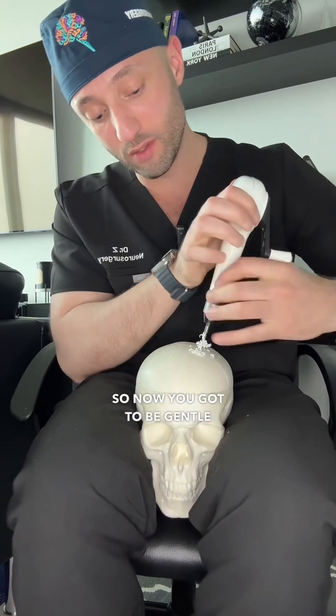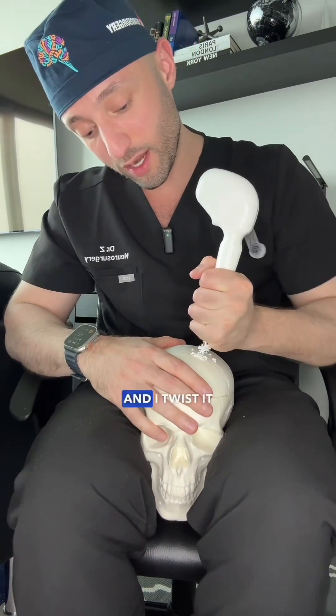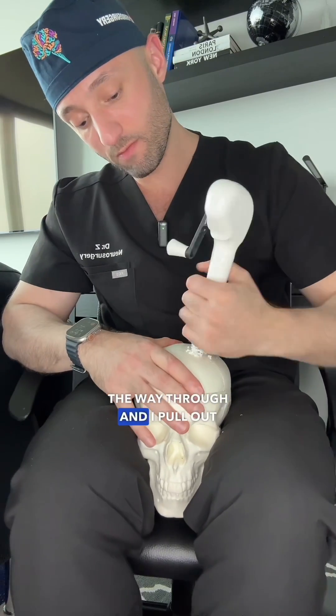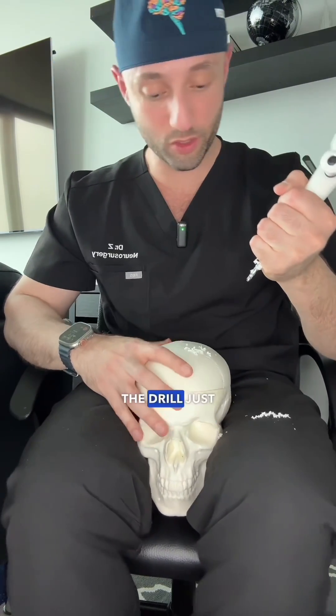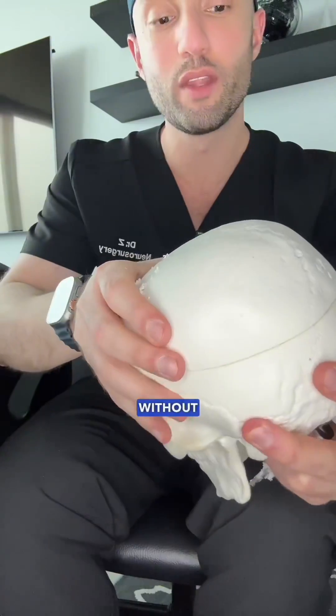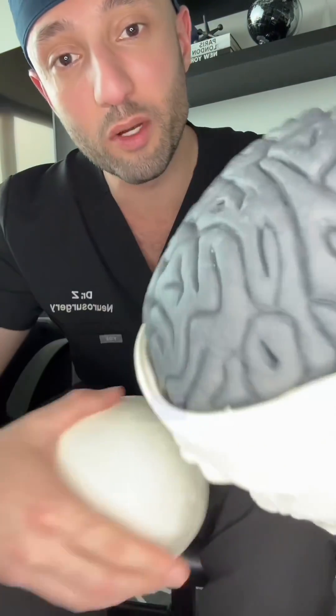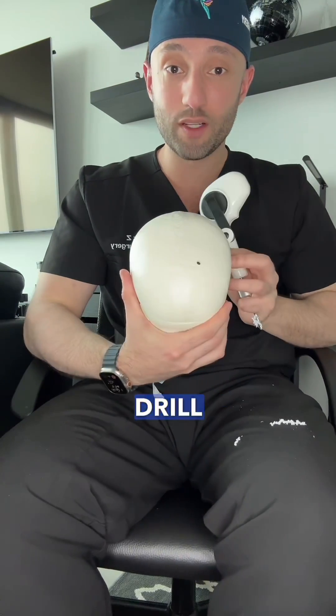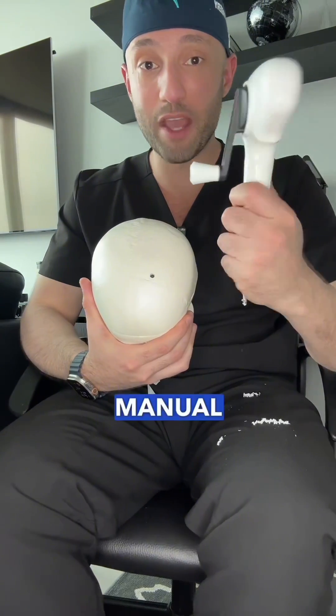Now you have to be gentle. I take the drill and twist it manually just like this until we are all the way through, then I pull out the drill just like that. As you can tell, we have a successful hole without injuring the brain. Nice! Just a little bit of bone dust, but there you have it — that is how we drill a hole in someone's skull with a manual hand crank drill.